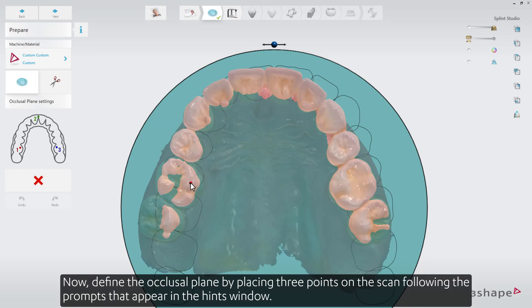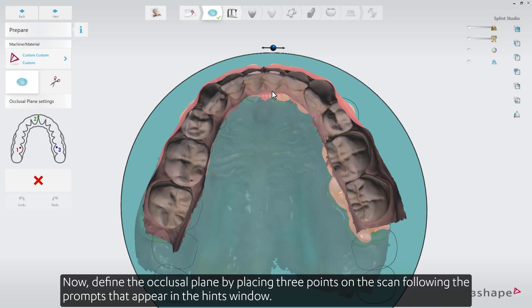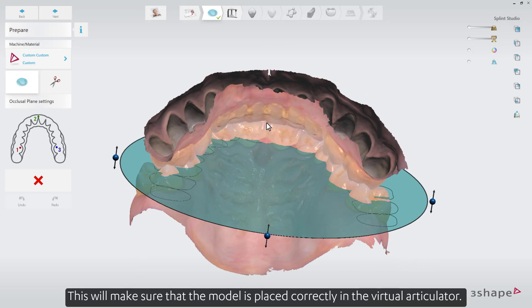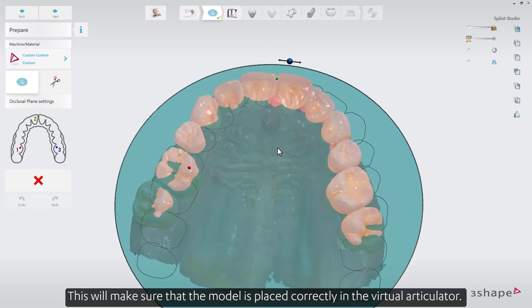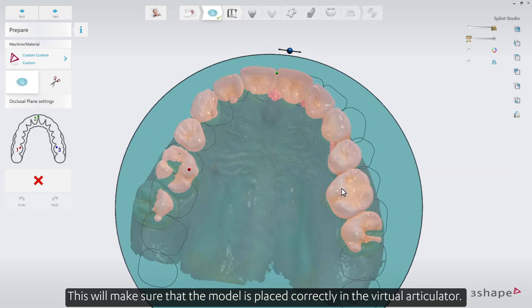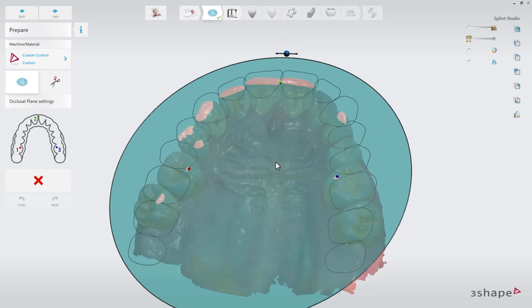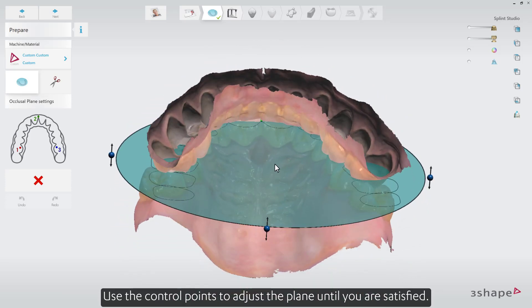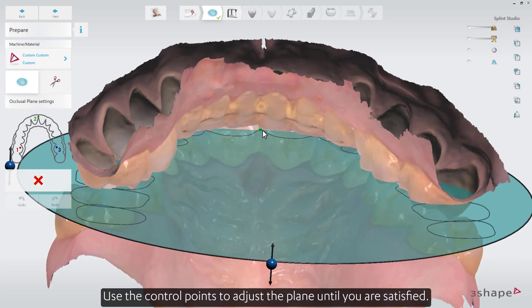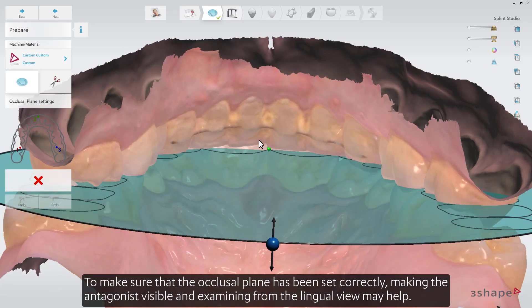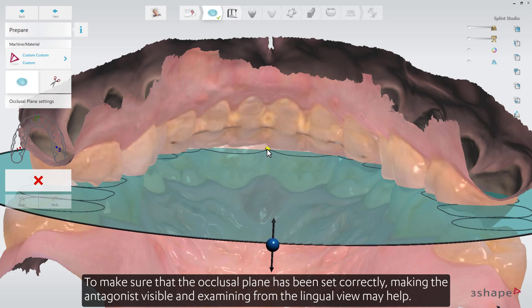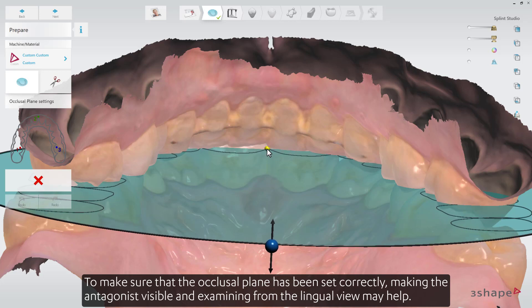Now, define the occlusal plane by placing three points on the scan, following the prompts that appear in the Hints window. This will make sure that the model is placed correctly in the virtual articulator. Use the control points to adjust the plane until you are satisfied. To make sure that the occlusal plane has been set correctly, making the antagonist visible and examining from the lingual view may help.